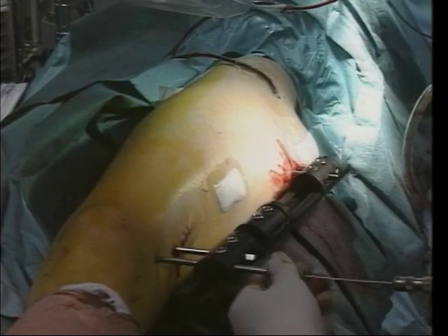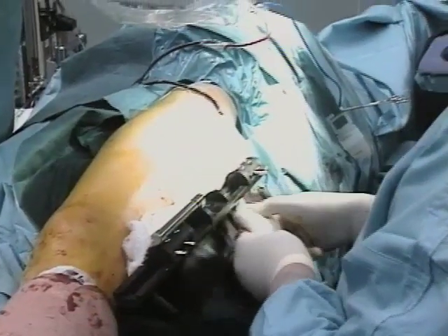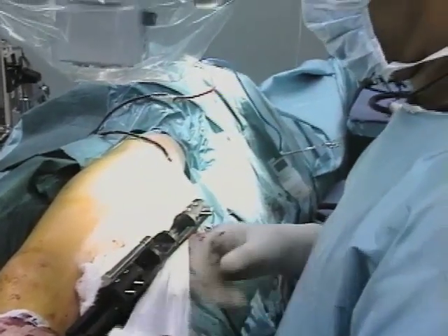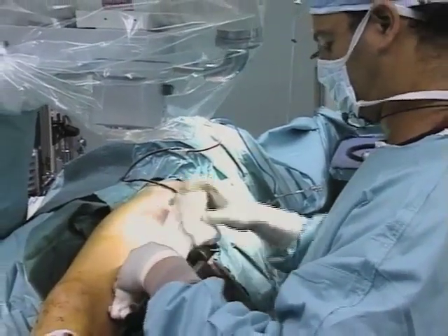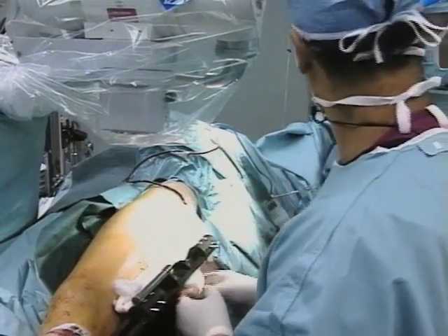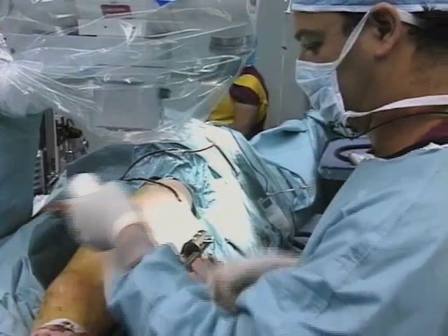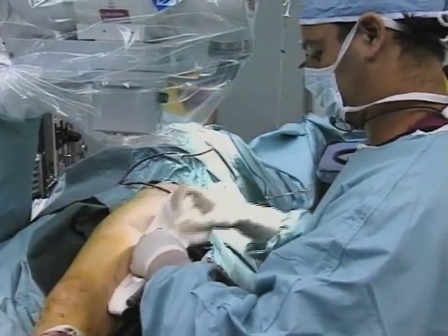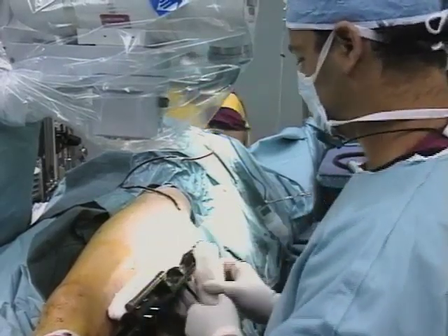If you put one or two wire holes in the wrong position, it really doesn't create any big problem. Rehabilitation is an absolute prerequisite for any lengthening. I don't think any surgeon or patient should consider entering a lengthening program, and especially not of the femur, unless a vigorous physical therapy program can be part of the total package.